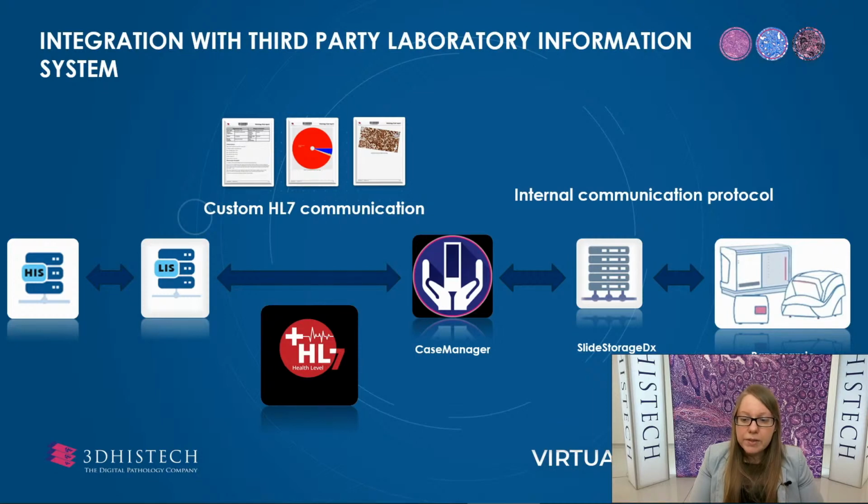The basic integration workflow is when a new case is created in the laboratory information system. It sends the case and patient data to Case Manager, which opens the same case in its database. The laboratory information system can send additional information to Case Manager anytime to update the case before it's closed.